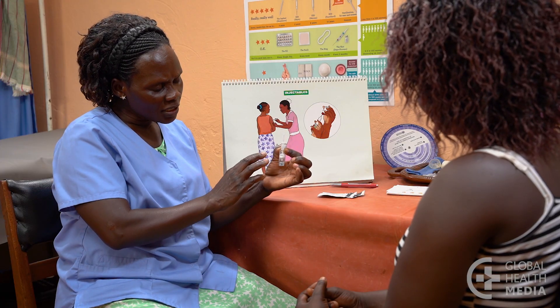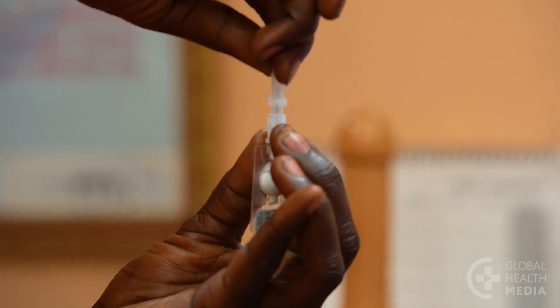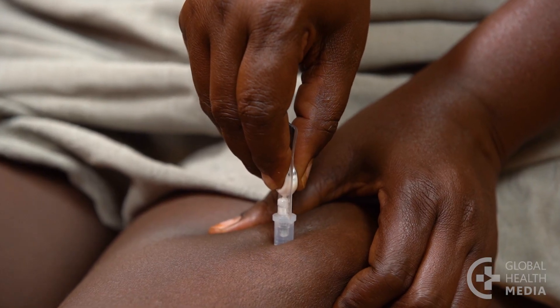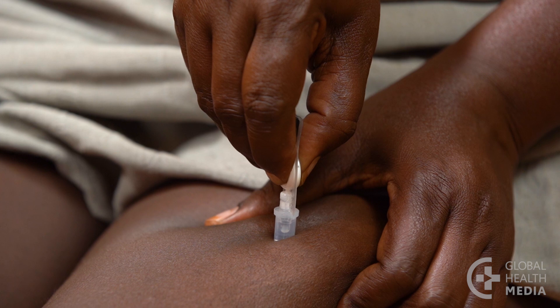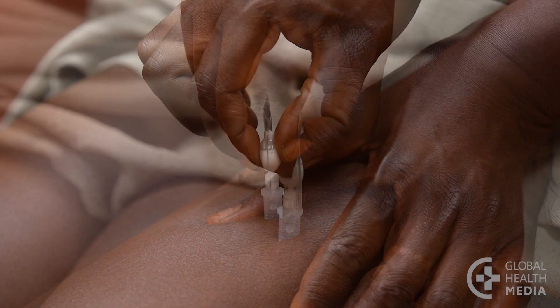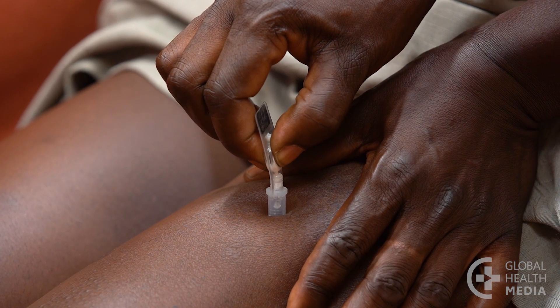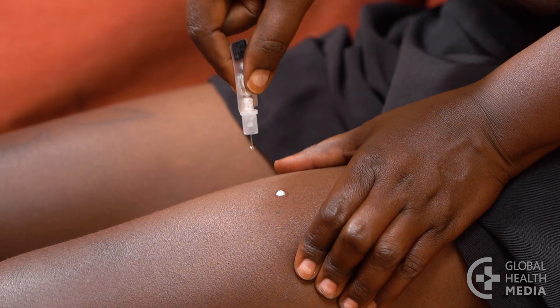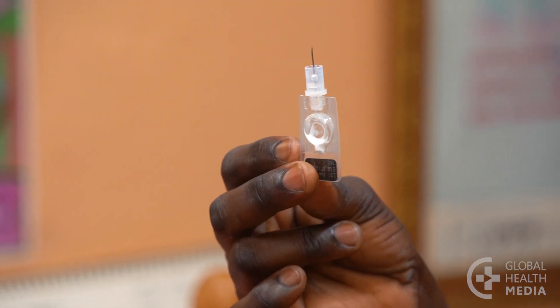Alert women about two common issues. First, it's not so easy to close the gap — she will need to use a little force to push the two parts together. Second, if the woman doesn't firmly pinch the reservoir, she may leave medicine inside and not get her full contraceptive dose. The reservoir is made of firm plastic and needs to be directly and firmly pinched between her fingertips to push the medicine out. Assure her that it's okay if a small drop leaks onto her skin or if a little medicine is left in the reservoir.